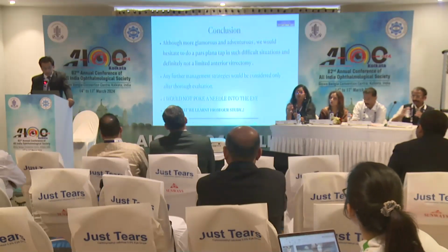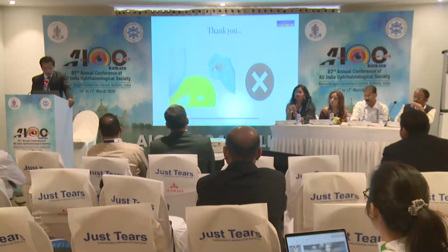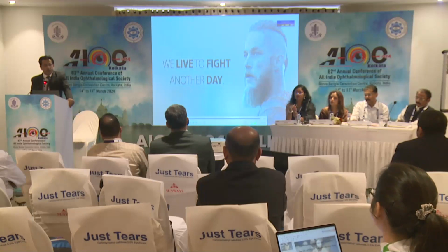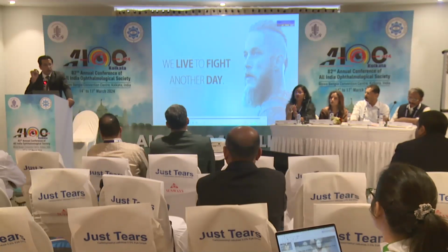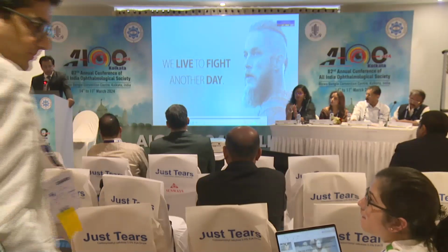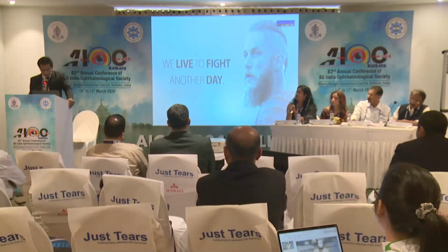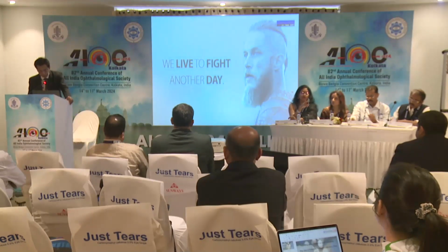Although it is more glamorous and attractive, I think it is very futile to try to poke a needle in through the pars plana, and definitely not to do a limited anterior vitrectomy, because we could end up having a disaster, since the differentiation is so difficult. It's just about buying some time. We want to live to fight for another day. So that was the message from this paper. Thank you so much.